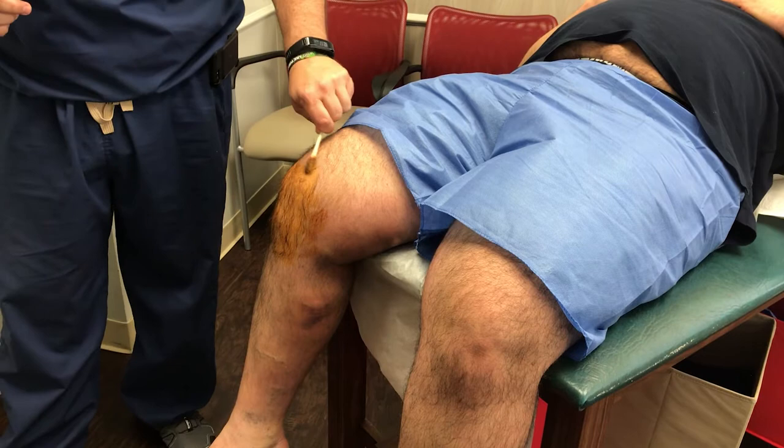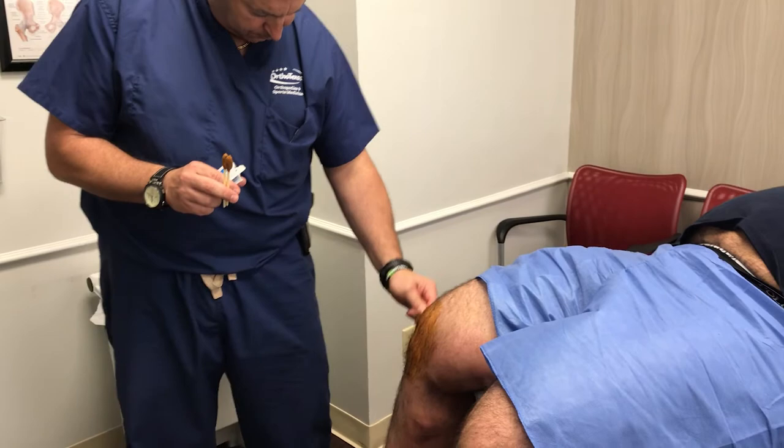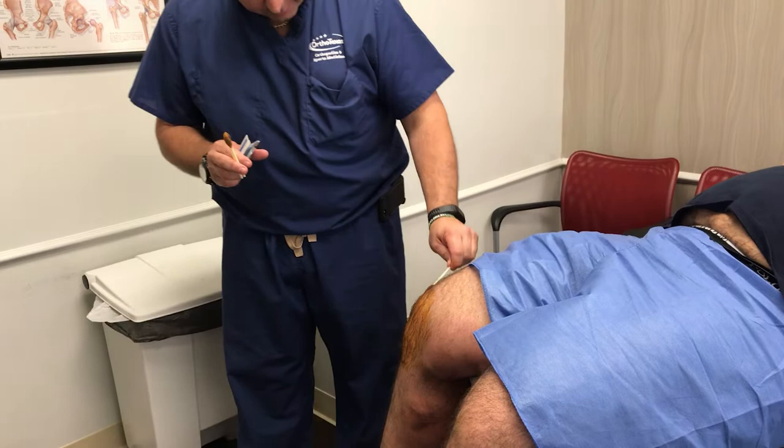In your case, because you've had some symptoms on both sides, I'll probably look on both sides. Oftentimes I'll only look on the one side where the issues are more pronounced, but because you've had both we'll probably take a little bit more time and look at both. Would you be able to find out where this clicking is coming from through this scope?